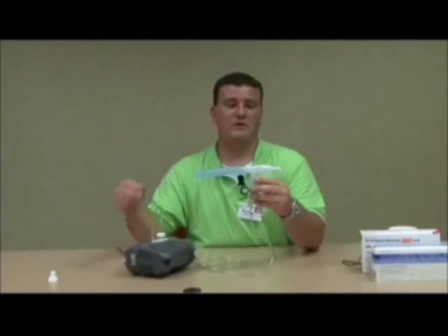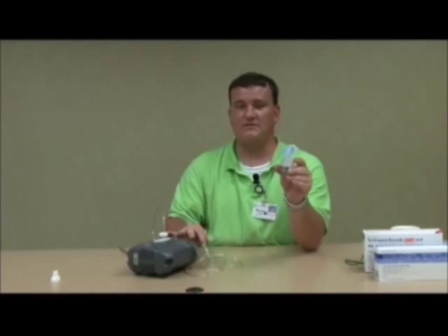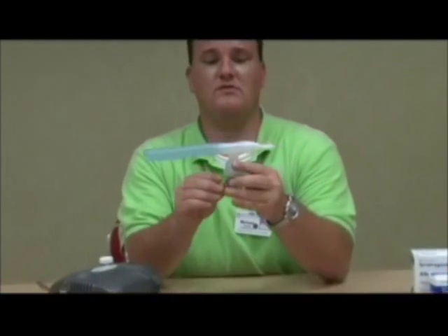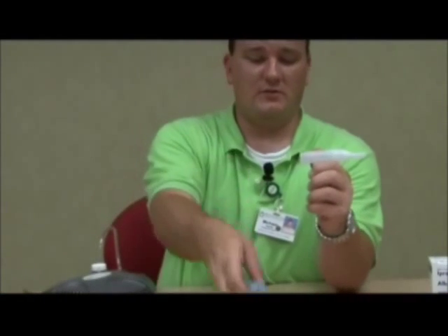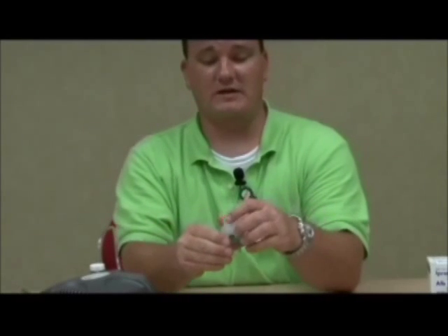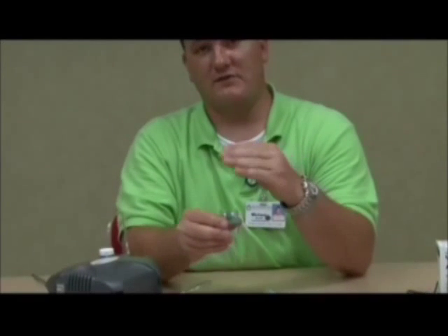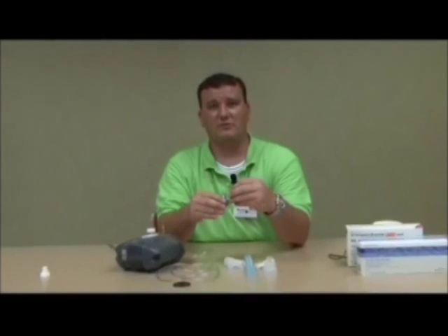Once your treatment is through, you will need to take your nebulizer kit to the sink and clean it. You will first need to detach the tubing on the bottom. Leave it connected to your compressor — the tubing will not need to be washed. You will need to take your kit completely apart. It's very important that you rinse out or clean your nebulizer kit after each treatment. You can typically do this with just warm water after each treatment, but the very last treatment of the day, you will need to clean it in mild dish soap and warm water, let it completely air dry, and replace your nebulizer kit at least every 30 days.